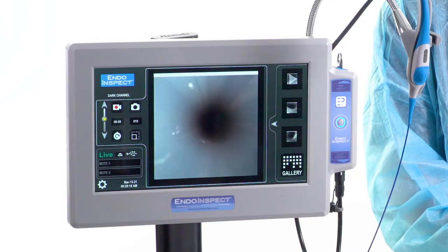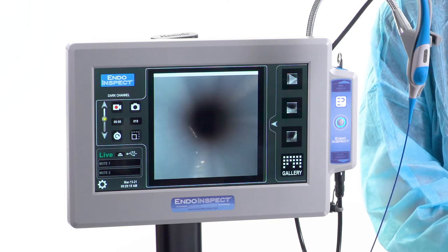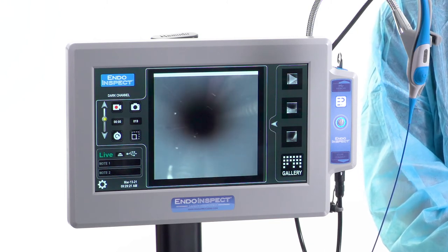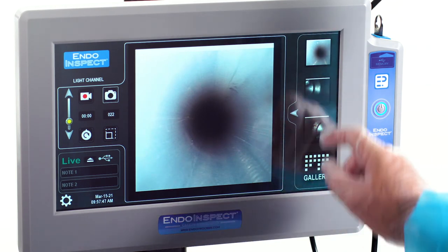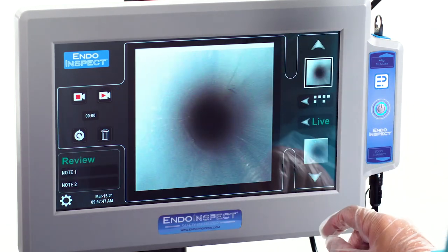A large 13-inch LCD makes detection of biofilm, debris and damage easy. The IndoInspect has a touchscreen display allowing you to capture video quickly, still images and notes.